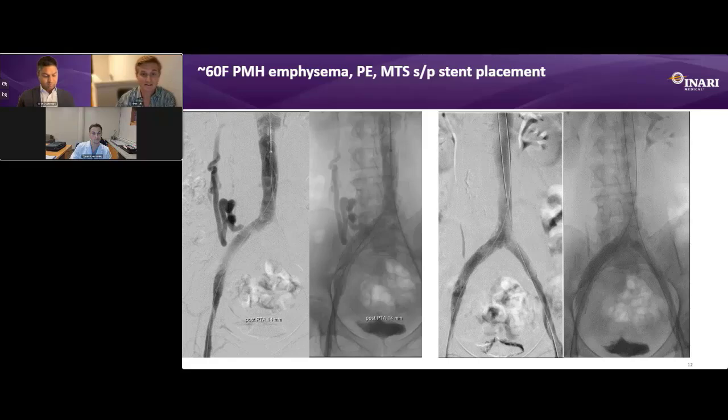And this was a 16 stent. So I finally did my final set of images on the right, where I took it to a 16 and then hit it with RevCore again. You can see we get a nice result with a nice clean lumen, and then a little bit of a pseudostenosis due to the increased flow in the external iliac and common femoral. And since the flow was so good, we did not extend the stent.